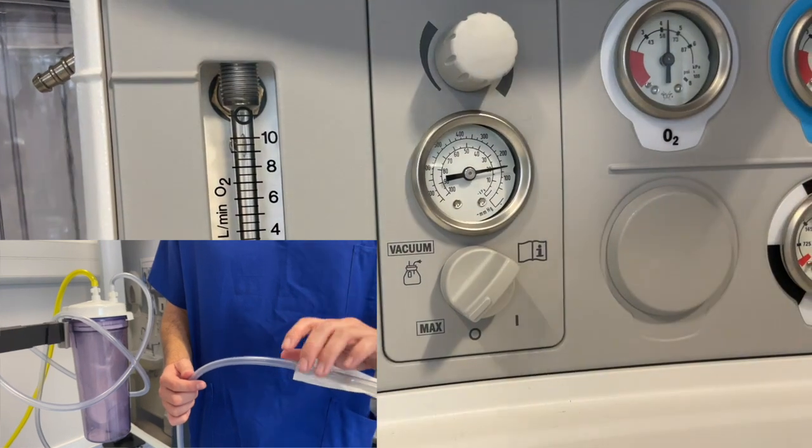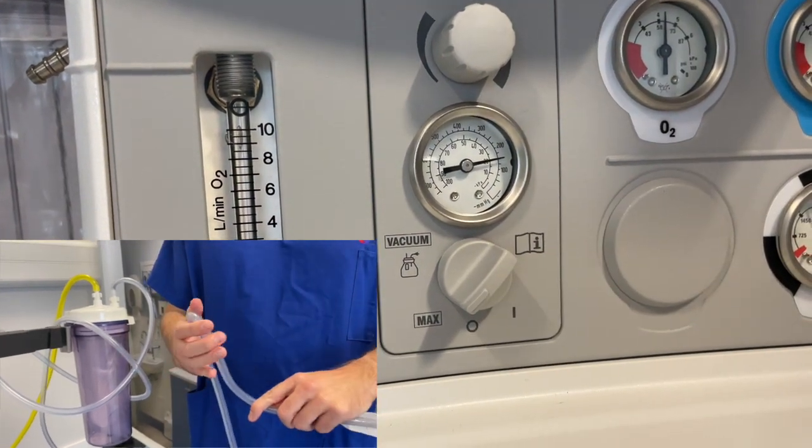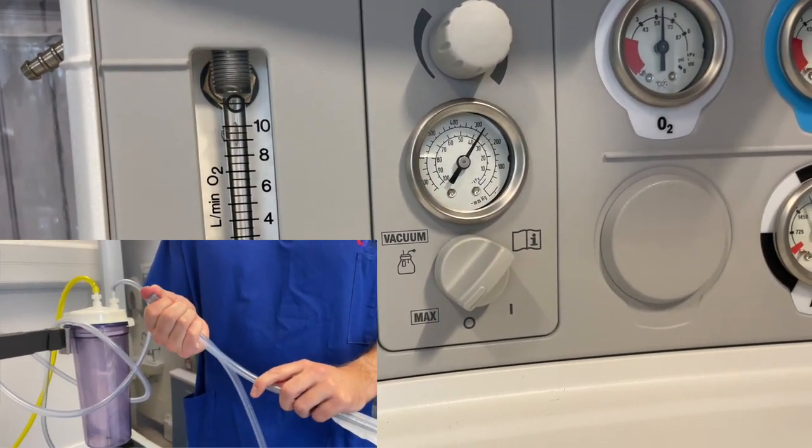If you have two vaporizers mounted onto the back bar, you can test this system by turning one on and attempting to turn the second one on at the same time. Test the effectiveness of the suction by occluding the suction tubing and watching the pressure build on the gauge.